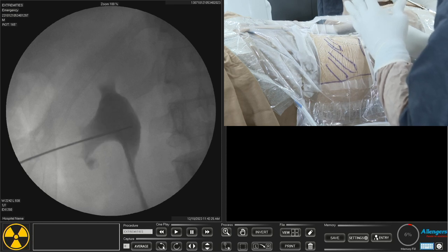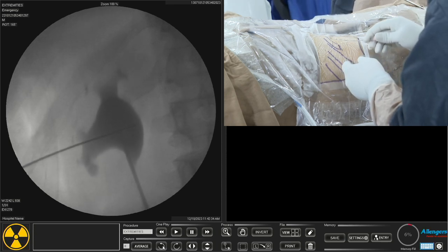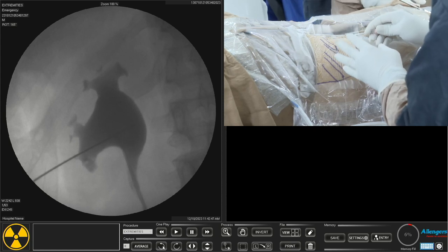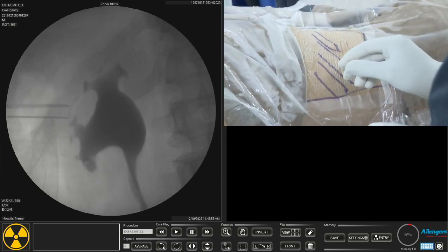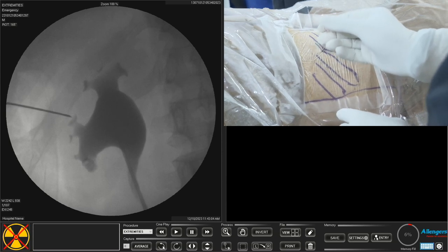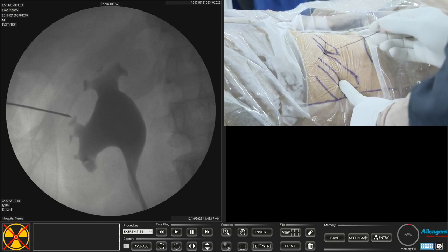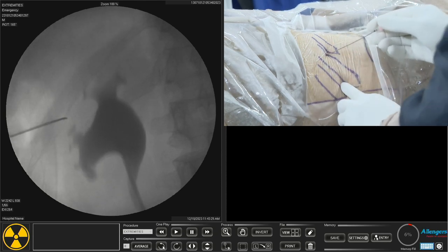I make a 50-50 mixture of contrast and normal saline. The calyces are not much dilated, but whenever possible we choose the most dilated one. In this case I can go to the lower calyx as it is the most dilated, or I can choose this calyx — if I choose this calyx I can easily pass my scope into the upper part of the ureter. There is a stone in the lower pole and in the renal pelvis.